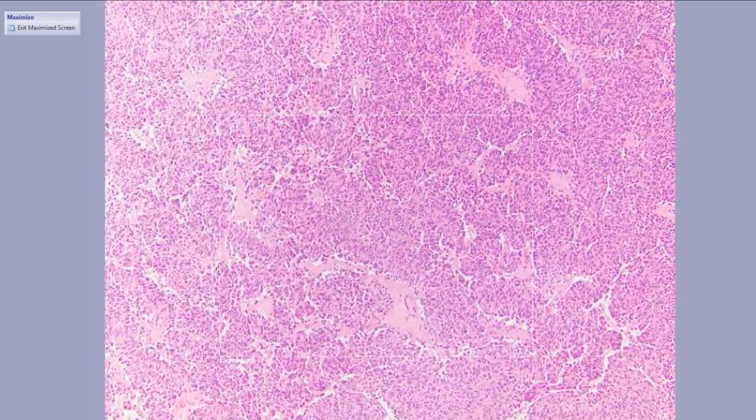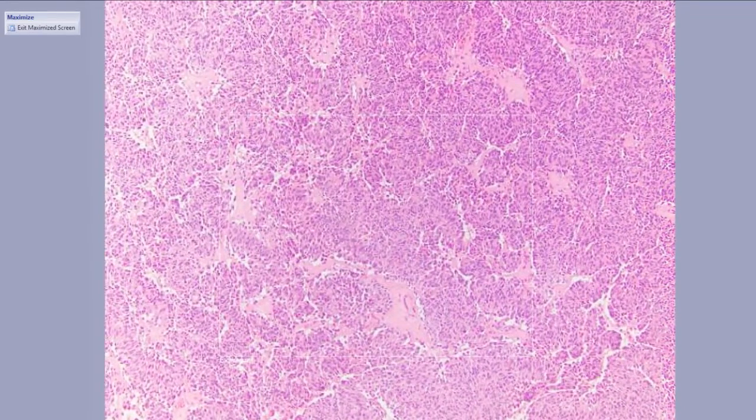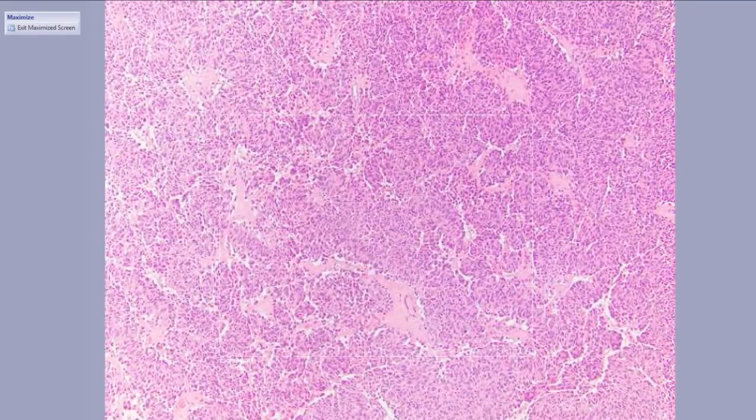Normal, unremarkable staining is retention of the nuclear protein. But in this lesion, the SDHB protein would not be expressed. It would be absent and therefore abnormal. And this is what we see in these so-called wild type or pediatric type GISTs, which are more common in younger patients, pediatrics to young adulthood.